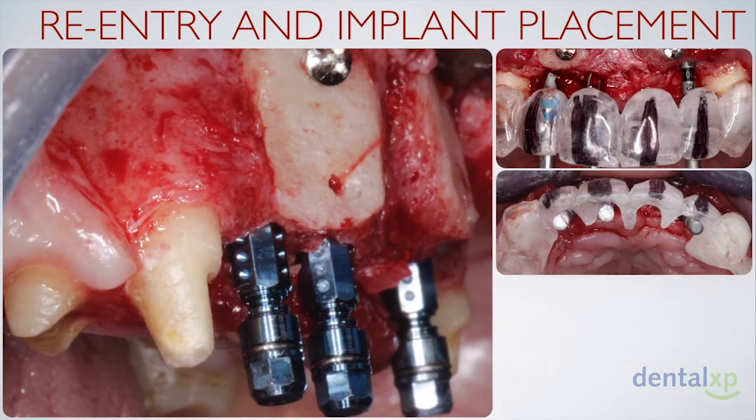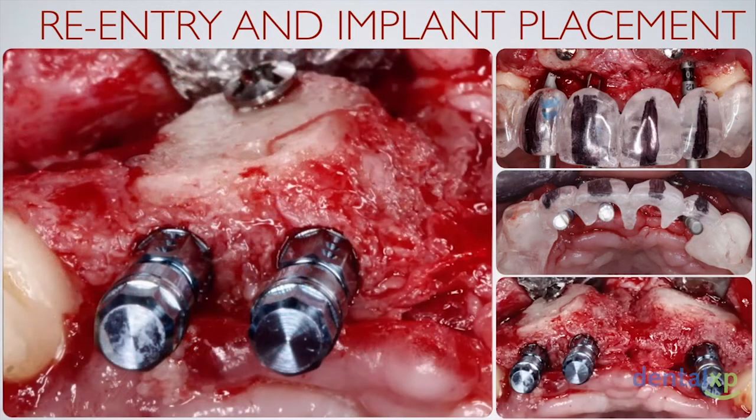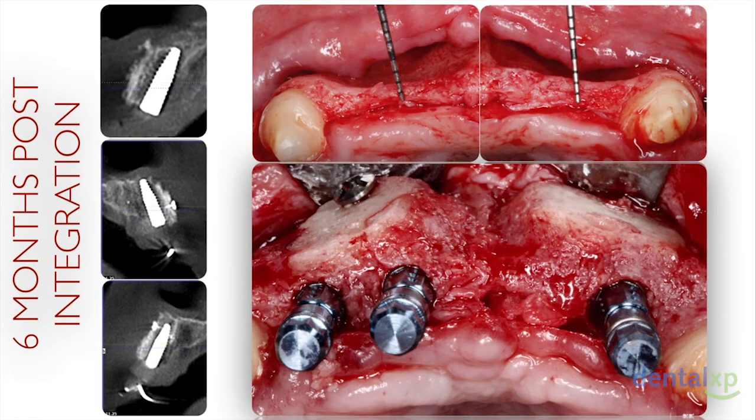And from the side views, you could appreciate the amount of buccal augmentation that was achieved as a result of this procedure, with very good, harmonious blending between the cancellous portion of the allogenic blocks and the patient's native bone. And this is just a pre and post-op comparison, with a 6 months post-integration CAT scan revealing maintenance of that buccal bone volume following implant placement.